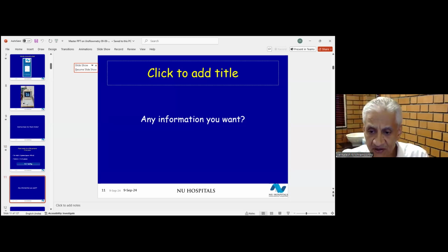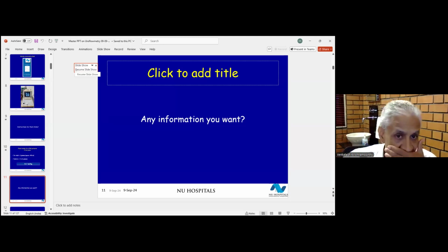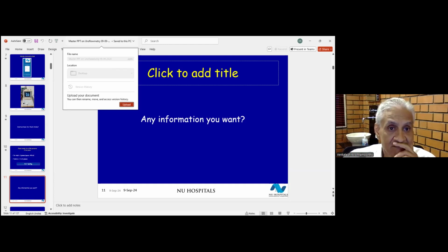Before you send the patient across for uroflowmetry, is there any information that you feel is important? Yes, sir. So basically, I would like to know the pattern, or the way he or she voids. There would be many patients from the rural area who would be voiding in a squatting position and not in the standing position. So the position in which the patient voids, and whether he will be able to normally replicate the normal voiding pattern, the voiding situation.